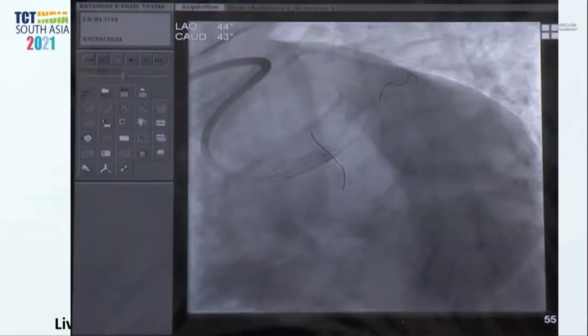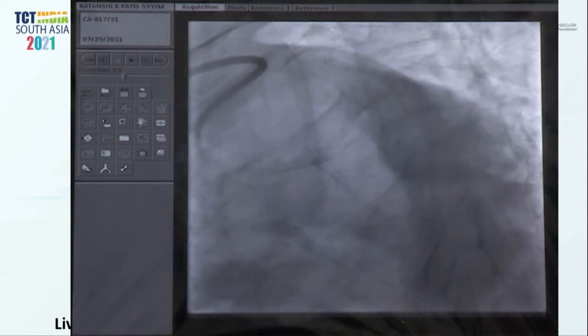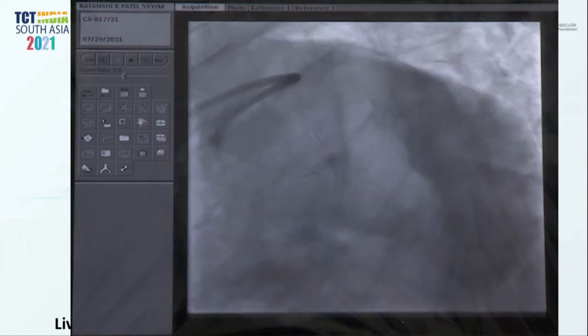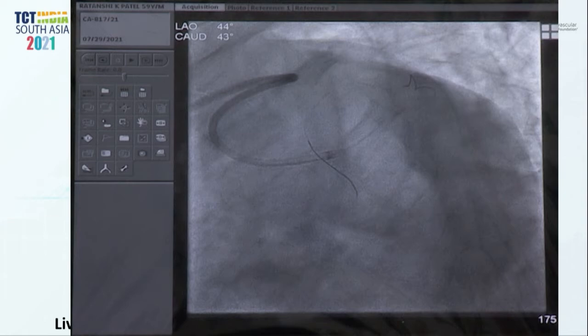Yeah. Since we could measure a 3.1 at the 3 millimeter stent, I think I'll go for a 3 millimeter stent. If it is the auto-lumen measurement, we can go 0.25 millimeter higher in size. I think we'll dilate EEL to EEL, the maximum size of the stent can be EEL to EEL. So we go for a quarter size or 0.5 millimeter next size down. And what are your comments on the distal vessel being smaller compared to the proximal vessel, which is bigger?